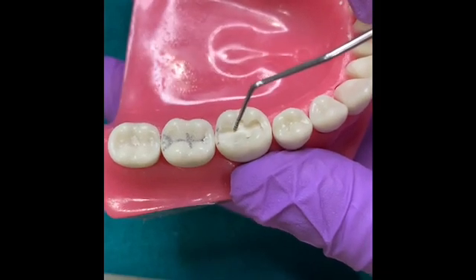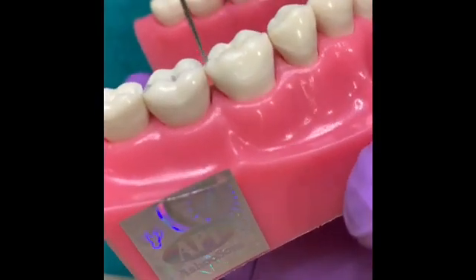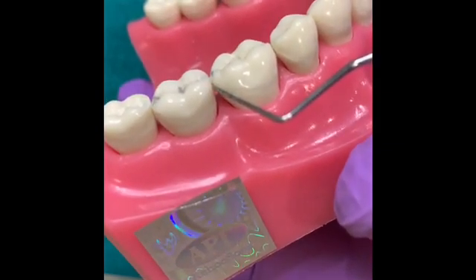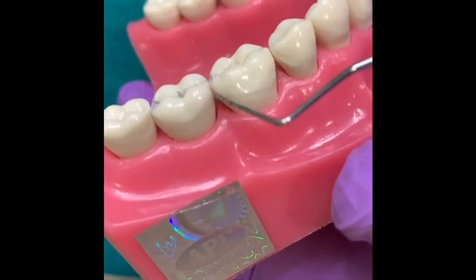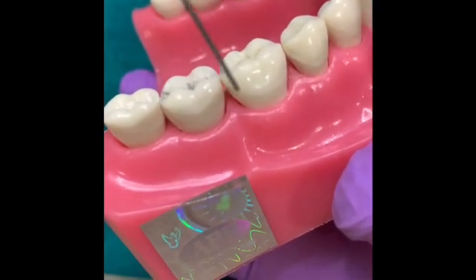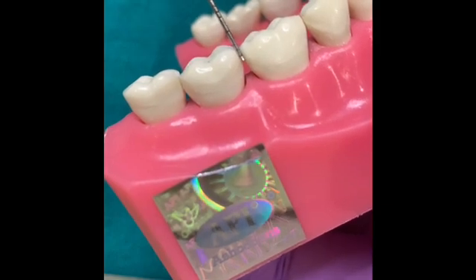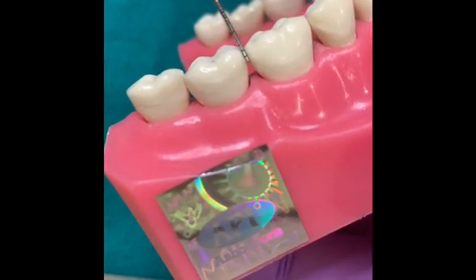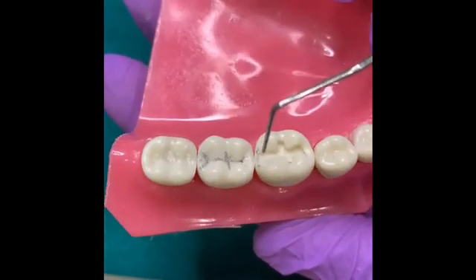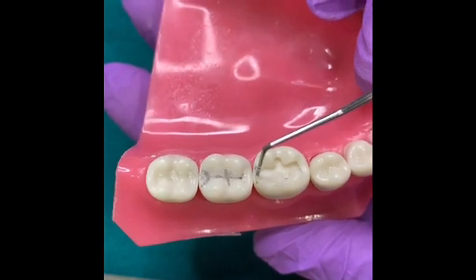The depth of the ditch will be till the contact point — and we have to proceed 0.5 mm below the contact point. We measure the depth externally with a probe, and it comes to around the third marking on this probe. In that manner, we will be about 0.5 mm below the contact. When we make the ditch here, we will measure the depth till the third marking of this particular probe. Let us proceed with that.